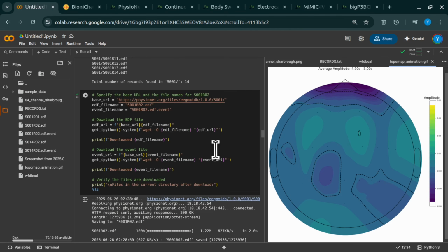So could you actually extract the events using the standard tools? Well, that was the real problem. We tried using a standard function in MNE-Python, mne.events_from_annotations. It's designed for this, but it only found one single event type in the whole file. T0. Just T0. But your forensic work suggests that there should be more. Exactly. That's what was so confusing. And it really highlights a common challenge in data science. Sometimes you get data, but without clear documentation for its specific format, interpreting it correctly is incredibly hard, like having a map in a language you don't speak.